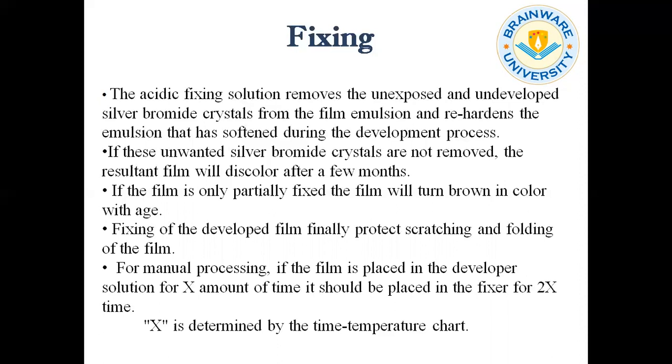As we have already discussed in the class, the developed radiograph should not be folded like paper. It should be rolled, and proper fixation will protect the outermost layer of the film from scratching.